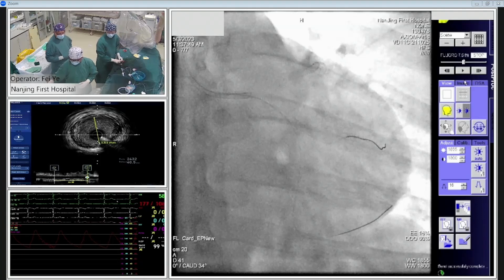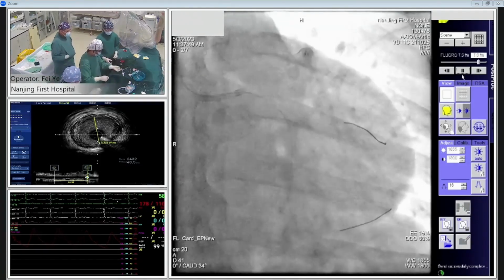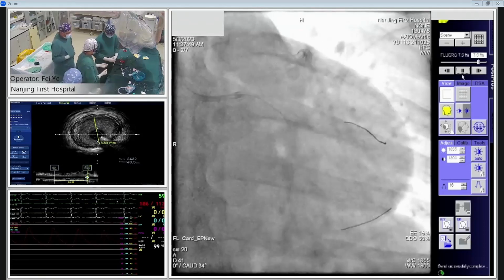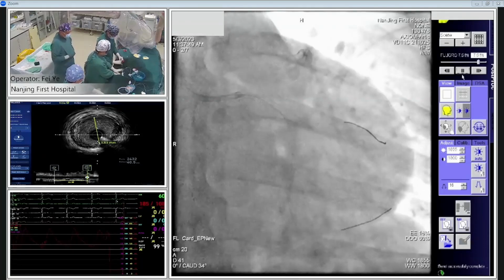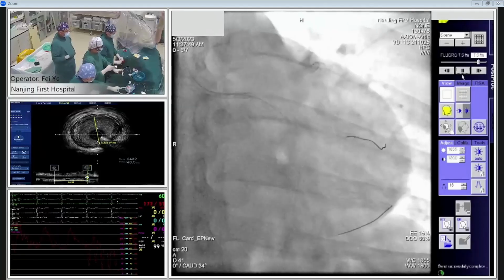That's why the dual lumen catheter has an advantage over the single lumen catheter when you revise the side branch: you can avoid the wire twist. So when we feel some resistance, we should avoid pushing the stent. So we use another stent, and we push the stent first.